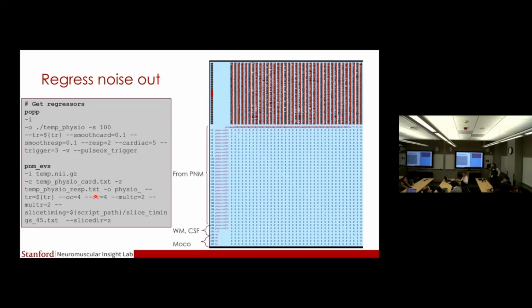So we already talked about this multiple times, but the white matter regressor is very concerning to me, because of the draining vein effect, you might have a strong correlation with the task inside this regressor. So you're basically removing variance of the task that you're after. I know, for example, Christine doesn't like to remove it. My PhD supervisor was like, you can't remove it because there's a lot of partial volume effect. I know you tried removing and not removing it, and the results were comparable.